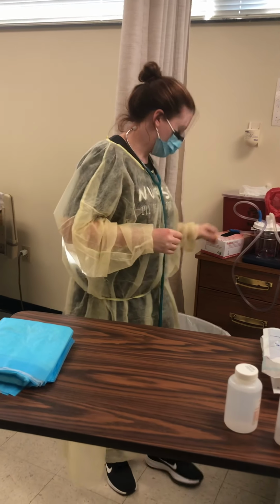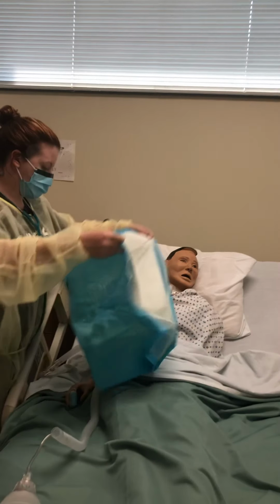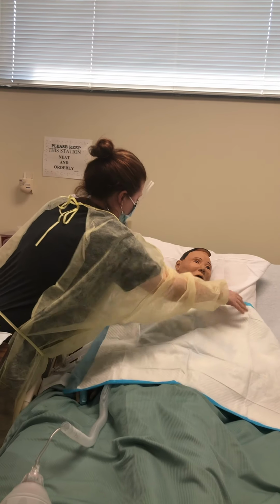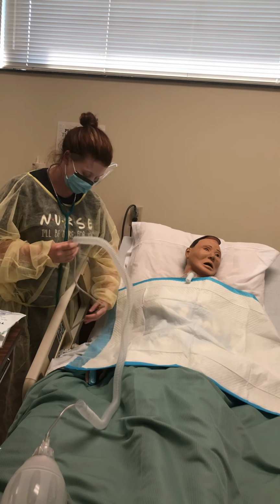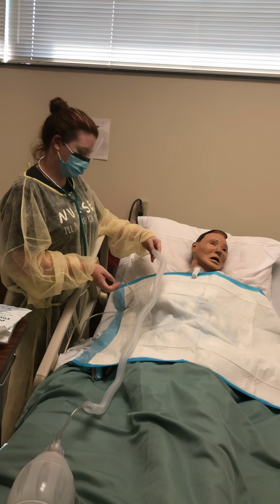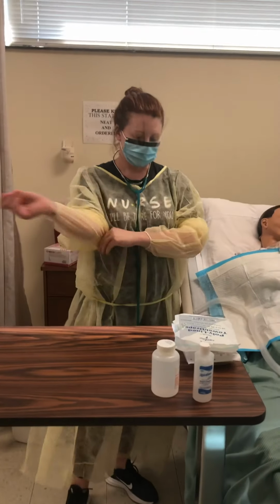Next, I'm going to drape my patient. And I'm going to hyperoxygenate him for a minimum of 30 seconds with 100% oxygen with tubing similar to this. And next, I'm going to set up my sterile field.